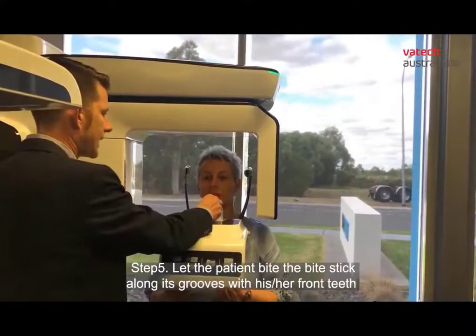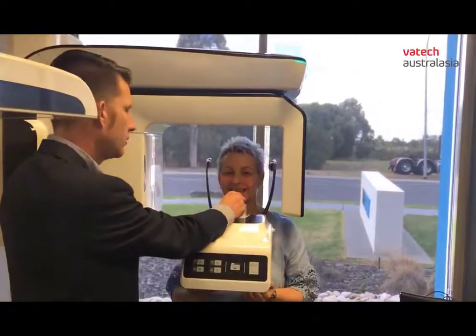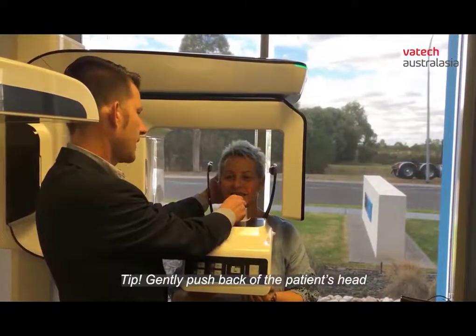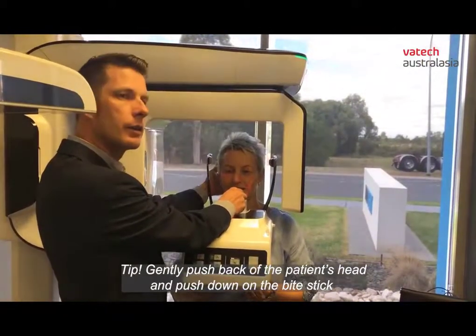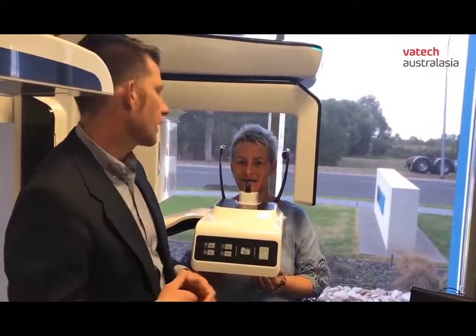Let's go ahead and open, bite on the bite stick, and smile really big. I can see she's in the bite stick groove. I'm going to gently push up on the back of the head and push down on the bite stick. That keeps the patient from doing this, where they hunch down.